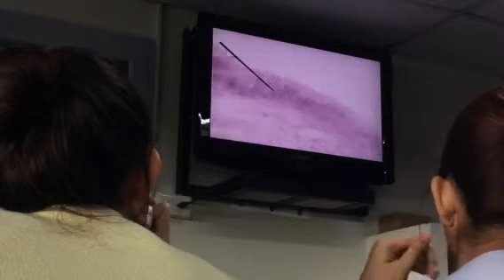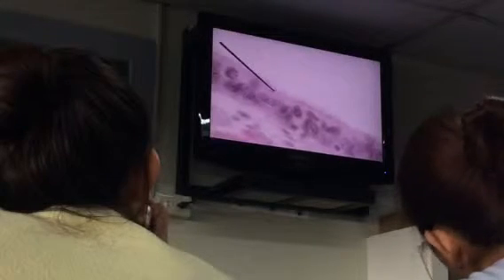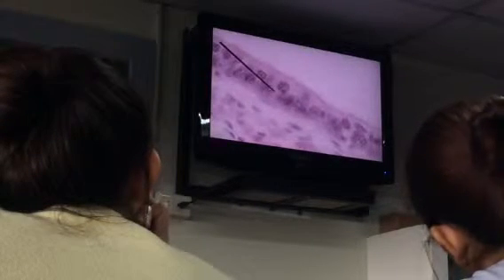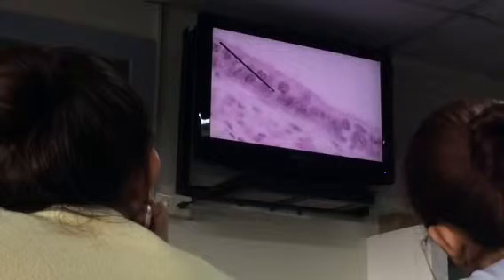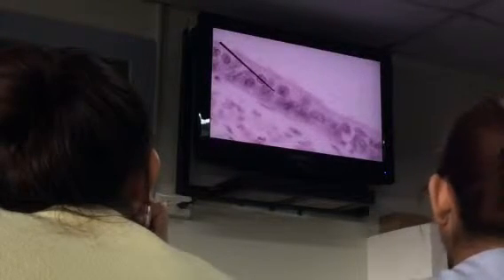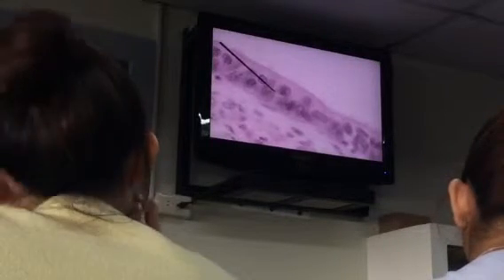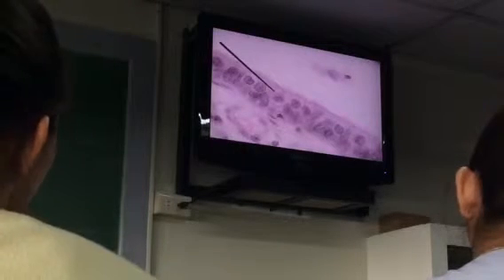I just like to look for one. Okay, there you go. It's clearer and larger, and that is what you call your PEG cell. Hindi pig, ha? PEG. Okay? Ano pa tayo? PEG. There's another good PEG cell over there.